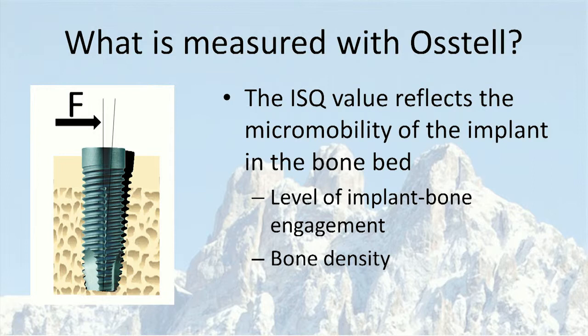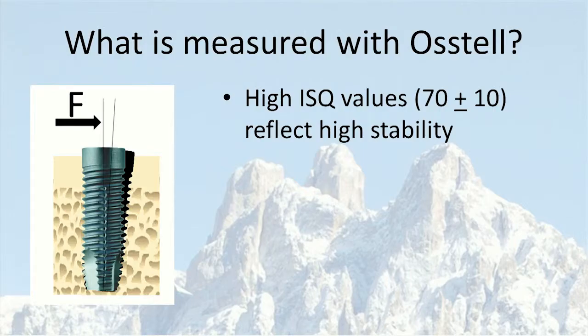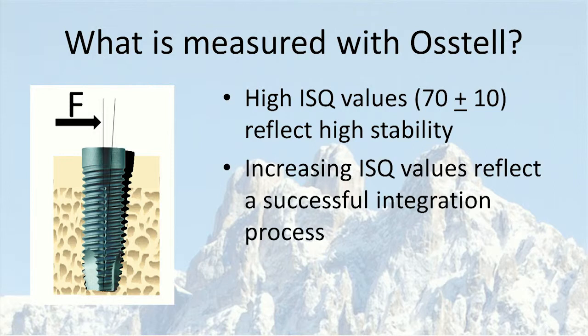And the factors deciding how much the implant is displaced, or the ISQ value, is the degree of bone density and how well the implant is engaged with that bone density. So it's again all about bone density, surgical technique, and the implant design. We can also conclude that high ISQ values reflect high stability and successful implants. We have seen that increasing ISQ values reflect a successful integration process, irrespective of which level we start.